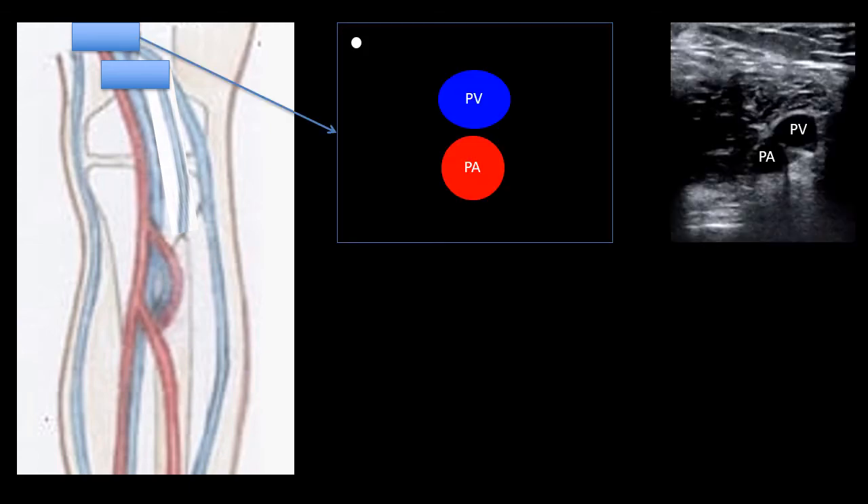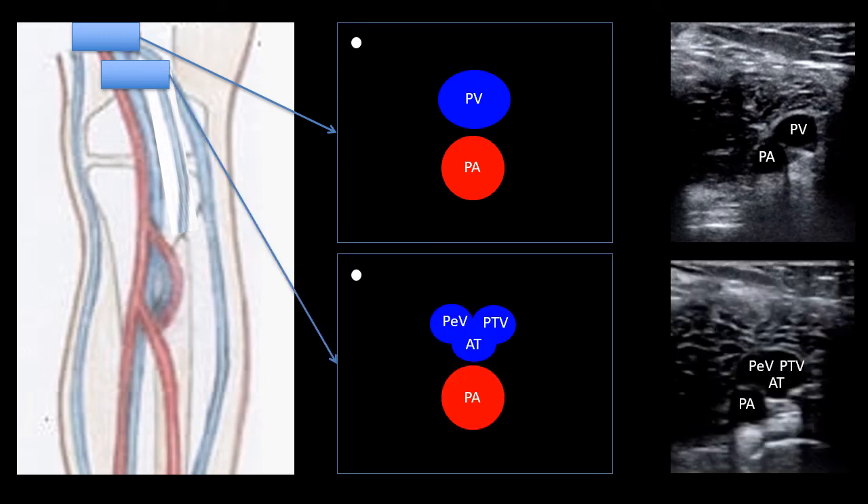That wraps up the femoral region. Next let's take a look at the popliteal vascular anatomy. Here we're looking at the posterior aspect of the right knee. The femoral vein has turned into the popliteal vein, which runs superficial to the popliteal artery. The popliteal vein then splits into the anterior tibial vein and the tibial peroneal trunk, which further divides into the peroneal vein and the posterior tibial vein. Note that this patient's popliteal vein actually runs slightly lateral to her popliteal artery.